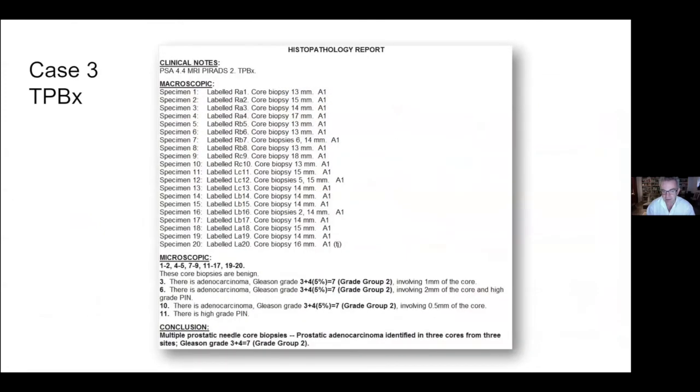Most of them are, I think, reclassification. But I think he had very good biopsies then. Your peripheral zone on the right would have been very well sampled, and that's what we do active surveillance for, isn't it? It's delayed selective intervention. Some men will progress. The challenge is to pick them up early enough, and it looks like you did. Well, hopefully. Okay, next slide.